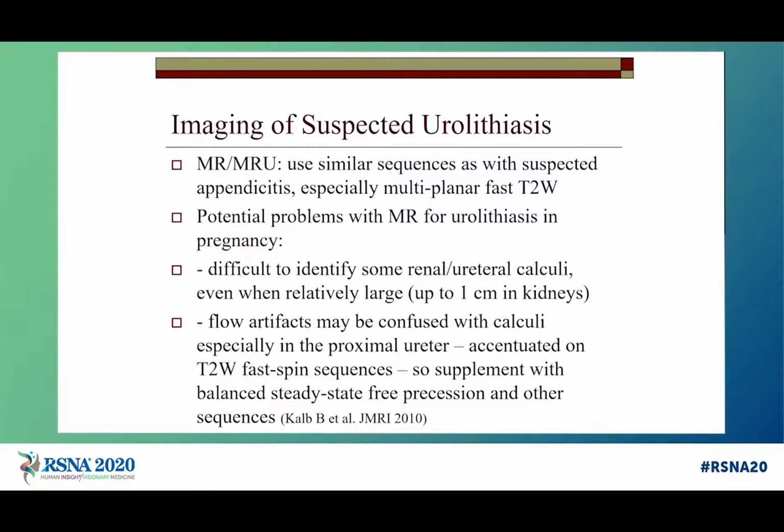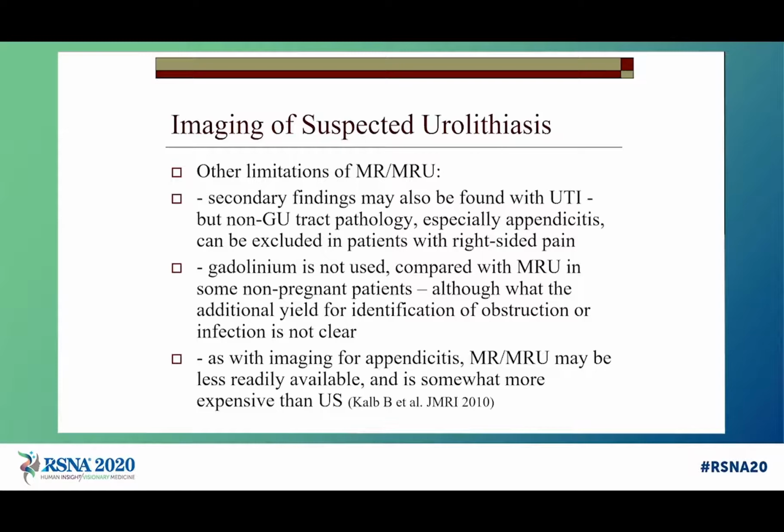In addition to other kinds of sequences, because you may have artifacts, we would do steady state free precession sequences and other sequences. And so if it really persists in all planes and all sequences, then that would fit with a true calculus as opposed to a fake out, a pitfall of flow. Again, we're looking for secondary findings, which may help us even if we have a hard time making the diagnosis of actually seeing the ureteral calculi.